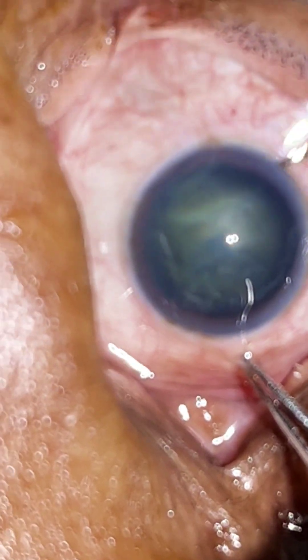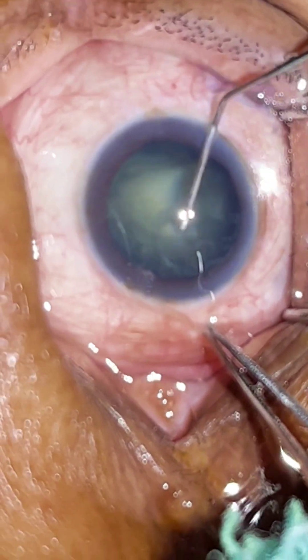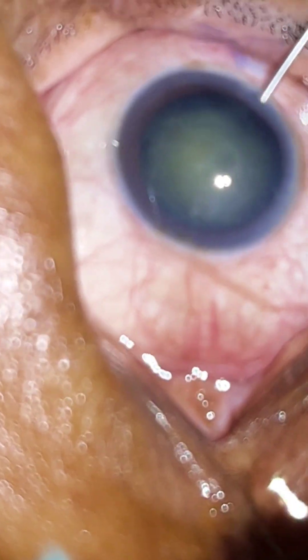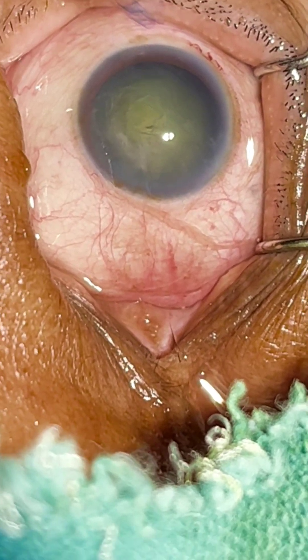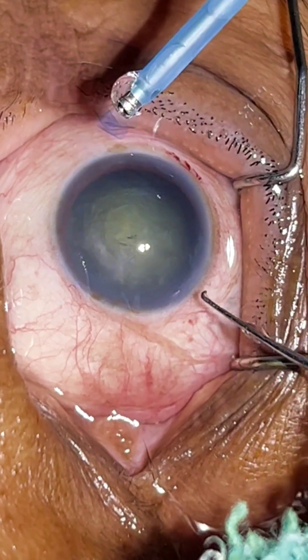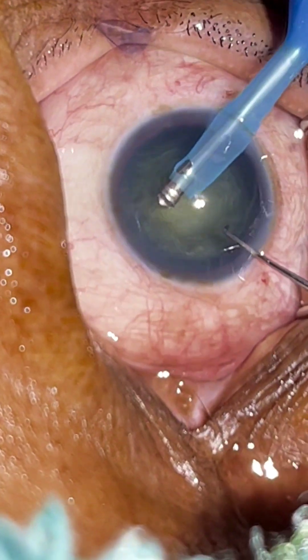So here we are done with the rhexis. Now I am going to go for hydrodissection. I usually don't do a delineation because we have to deal with the epinucleus. As I usually say, hydrodissection in any cataract surgery — whether phaco or SICS — is the silent key step. A good hydrodissection really makes the further steps easier.